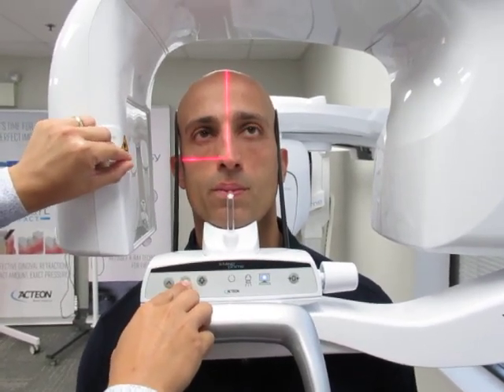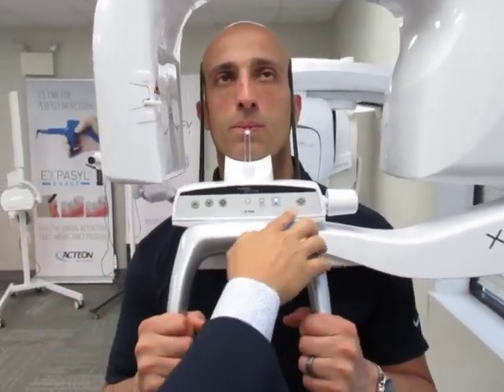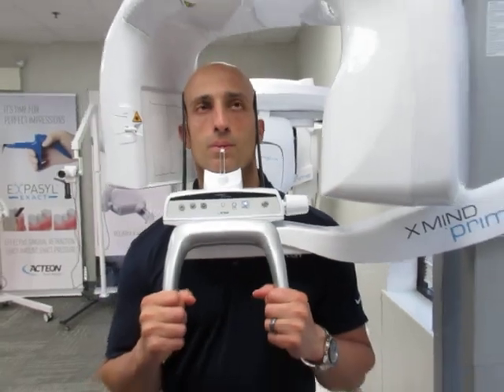All right. Once you get that to where you want it, make sure you're clearing his shoulders. You're going to press the zero to arm the machine, and then you are ready to expose.